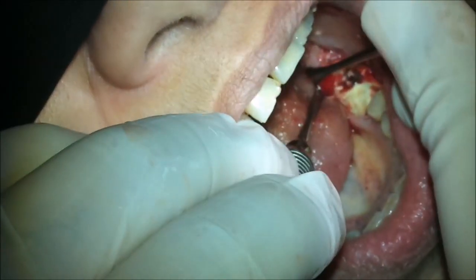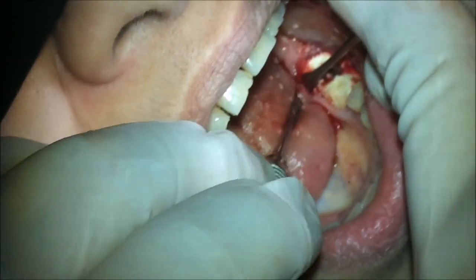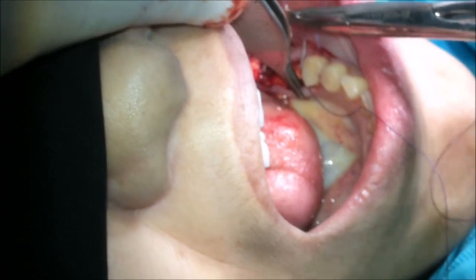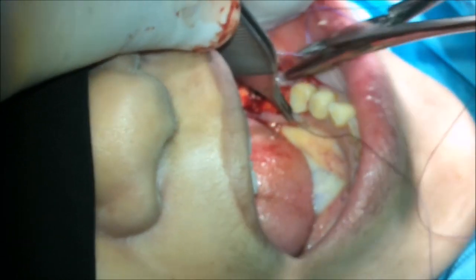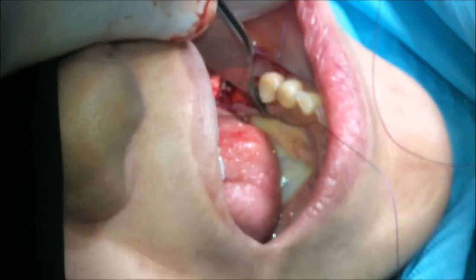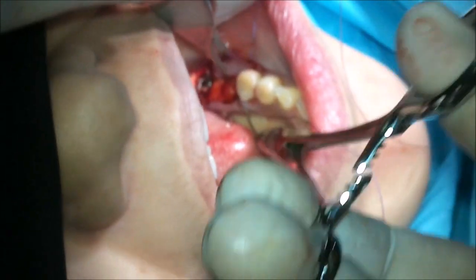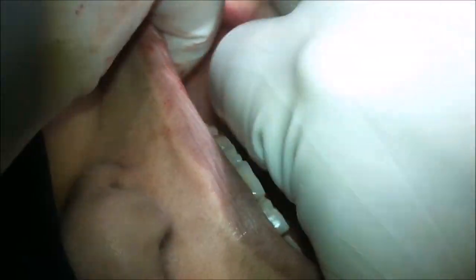Here we can nicely adapt the membrane in place, then suture the flap. I prefer to use the tissue forceps to hold the mucosa, not to remove the membrane from its place. And here we have the final closure of the case.